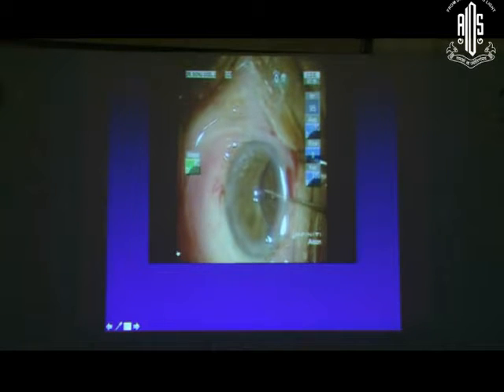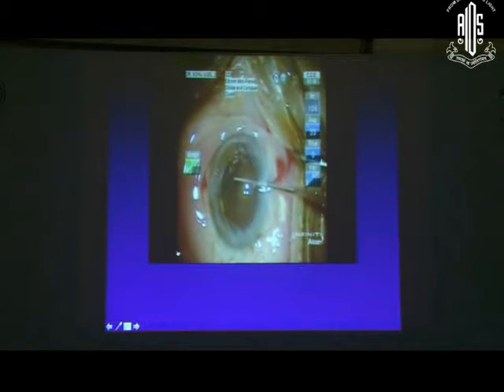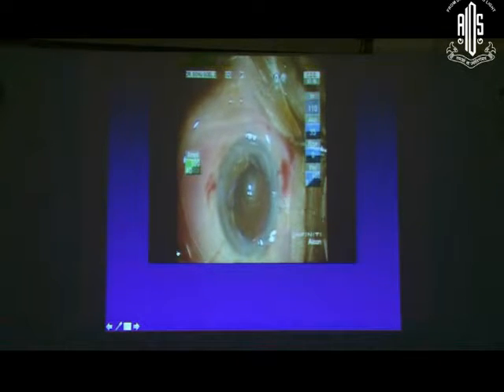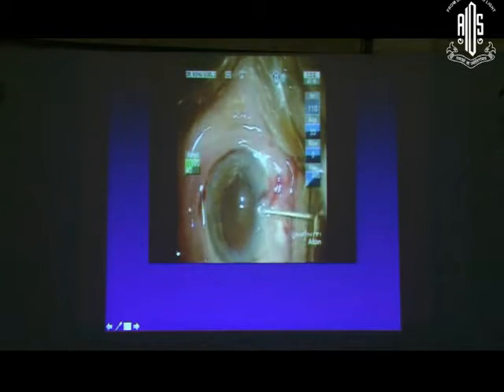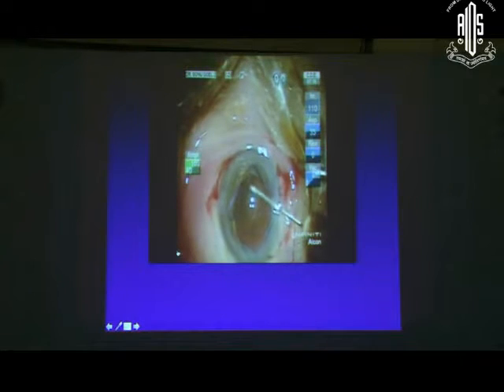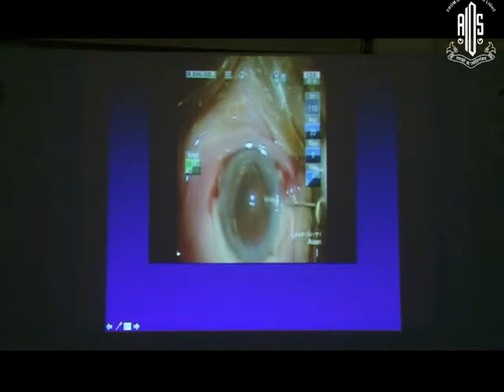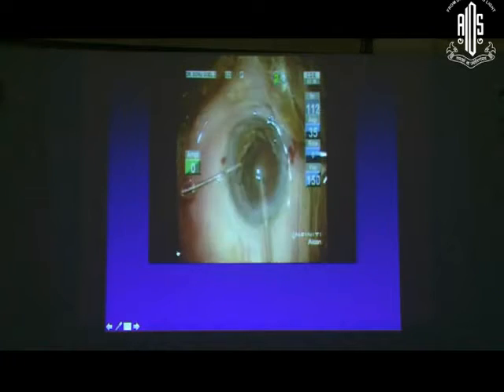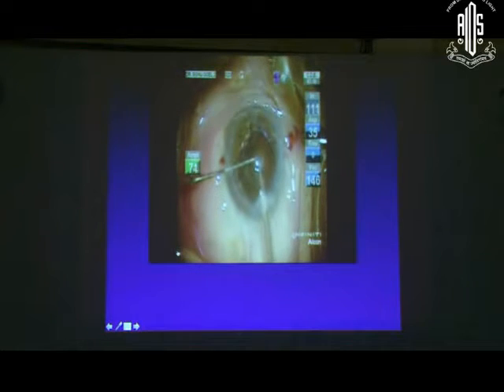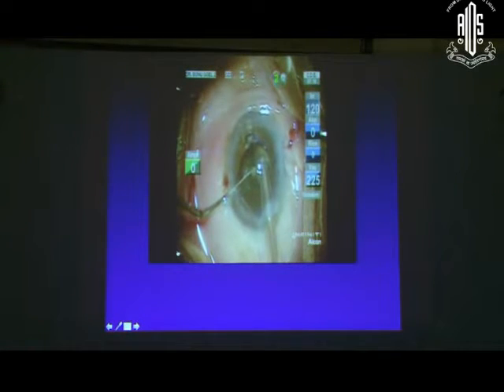And that gives you a good view by which a phacoemulsification or a combined procedure can be carried out in these patients where you have small pupils. And mind me, a lot of times, a lot of these patients have small pupils which are difficult to be addressed, and then a routine phacoemulsification can be carried out. Now this can be combined with trab, single site or dual site, but I usually prefer doing a temporal phaco and a superior trabeculectomy.